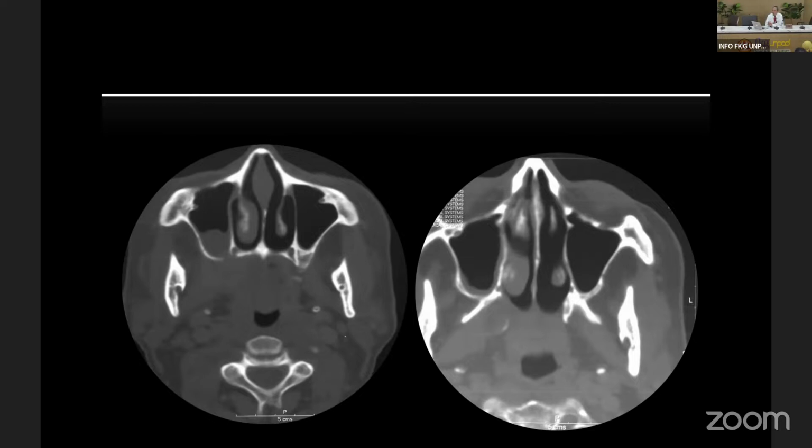You can see there's bone destruction in the posterior aspect of the maxillary sinus. So traditionally this is not what we see with sinus inflammation or sinusitis.